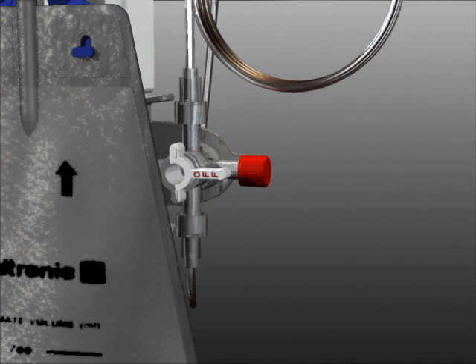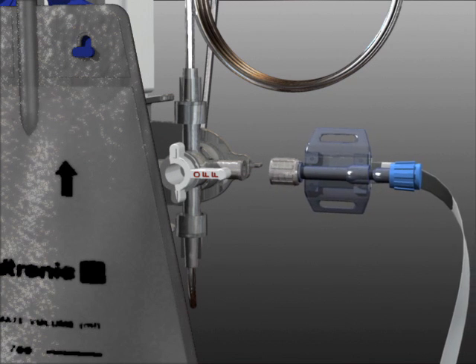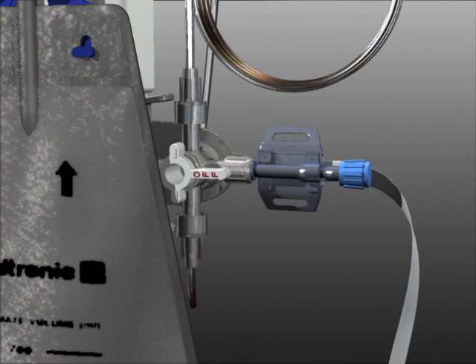A pressure transducer can be attached to the main system stopcock by removing the red cap and threading the transducer onto the stopcock lure fitting.